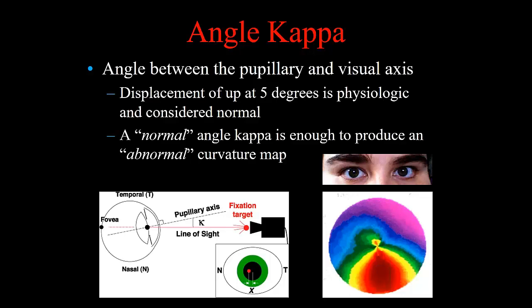Well, the Placido is effectively a light reflex test. And that infant who was effectively ortho but looked crooked on a Hirschberg would grow up to have an abnormal looking Placido map, but a completely normal eye.